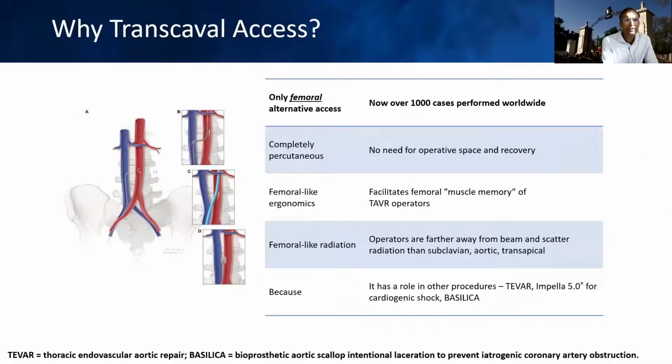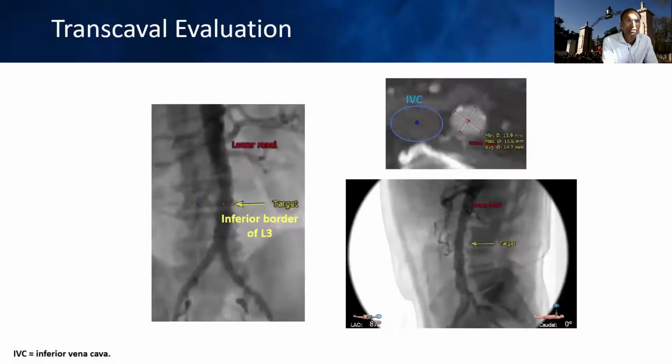Once we get catheters in position, typically with a 55-centimeter renal guide in the inferior vena cava and a standard guide in the aorta, waiting with typically a gooseneck snare, we can activate and electrify a coronary wire, typically an Astato wire, to go from the inferior vena cava, pass through the snare, capture and snare that wire in the abdominal aorta, and then transition this to a sheath. And then at the end of the procedure, close the fistula with an occluder device. We'll go through this in more detail in just a second.